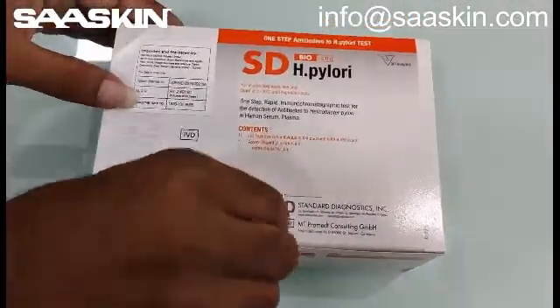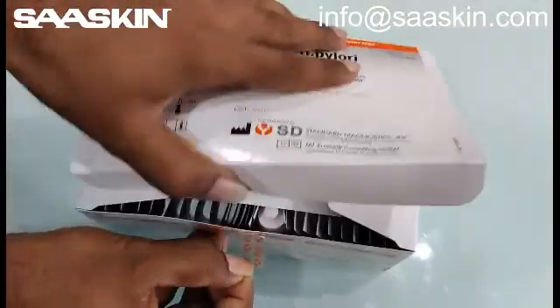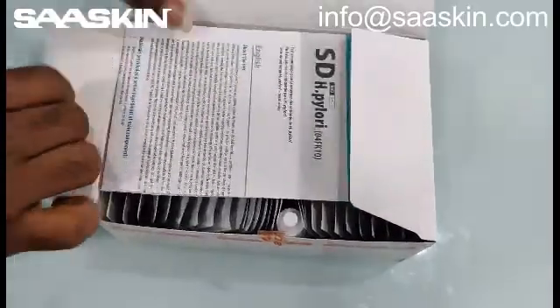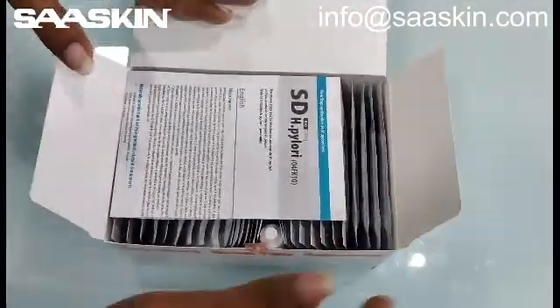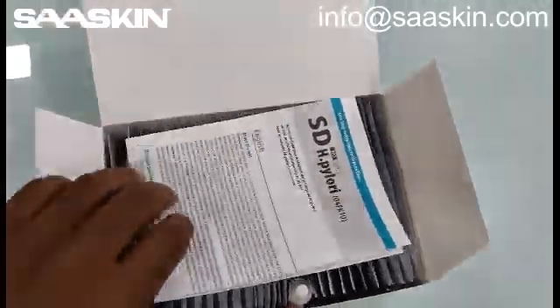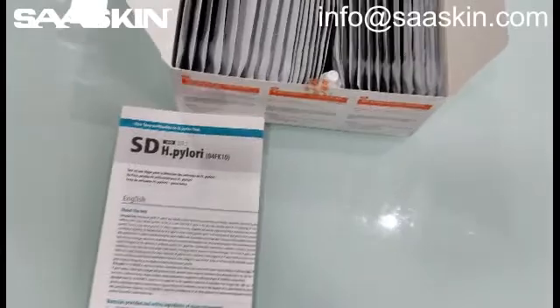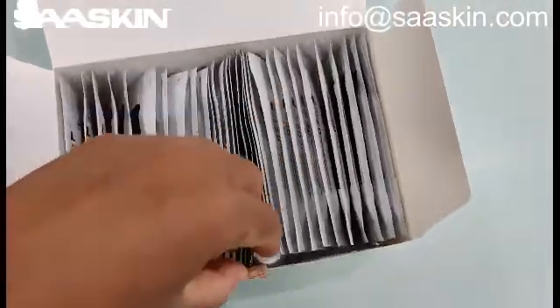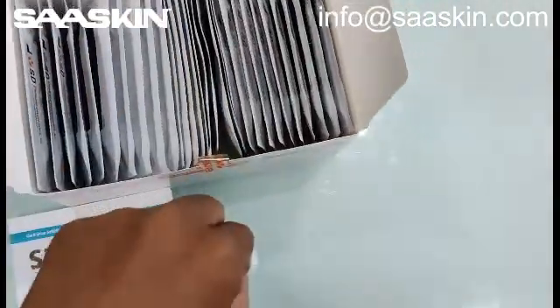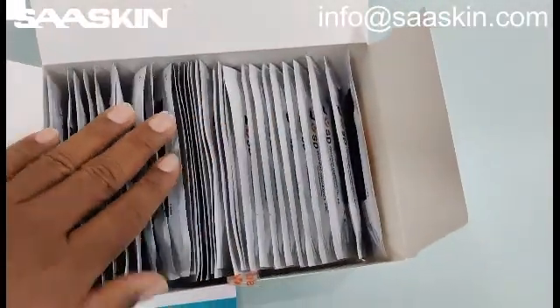Let me unbox this for you. The each box contains one instruction manual, a complete instruction manual, and there is one buffer solution bottle. And you have 30 test cassettes.